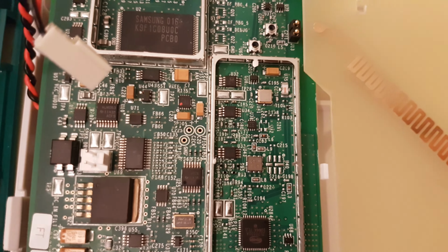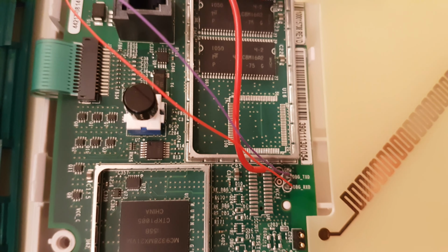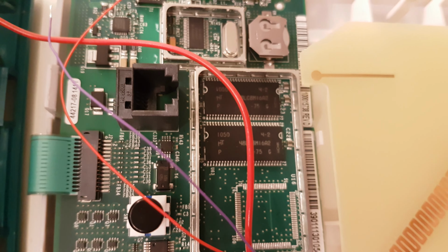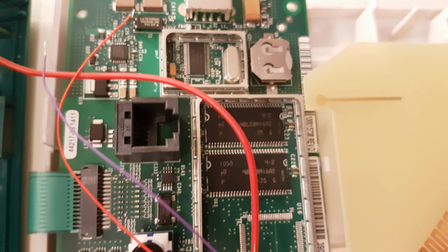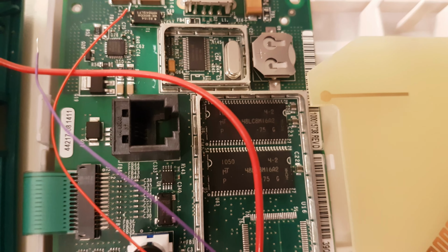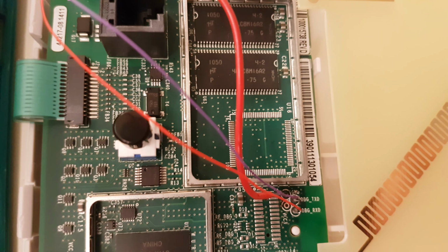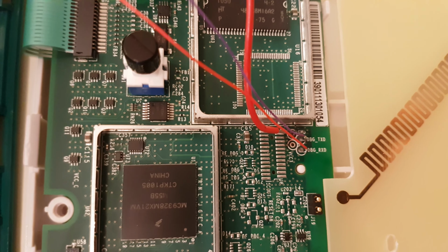So I didn't do a teardown video because I didn't really have the camera gear for it, but I thought I'd do a video of just a breakdown of what this Merlin at home 1150 is. It's a patient care monitor. Basically, they monitor your implanted pacemaker. It's designed to be installed beside your bed.